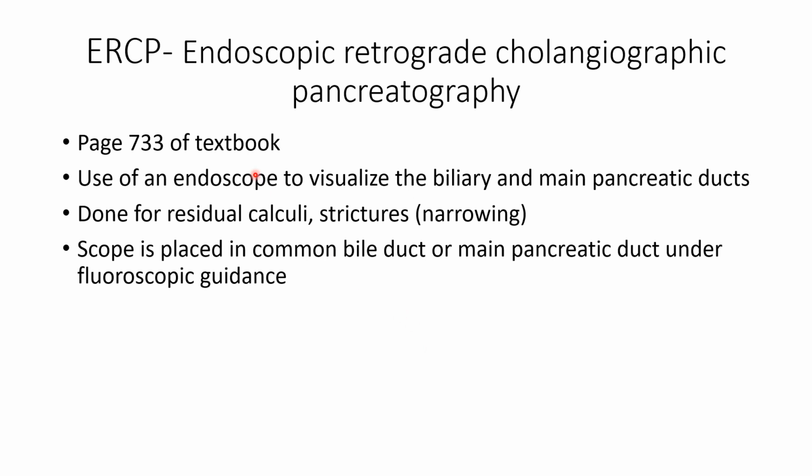But what it stands for, an endoscopic, means that they place a scope inside the patient, and what they do is they inject contrast media through the scope, retrograde or backwards, through the common bile duct and the pancreatic duct, and they look for stones or strictures or anything that could be causing an issue.